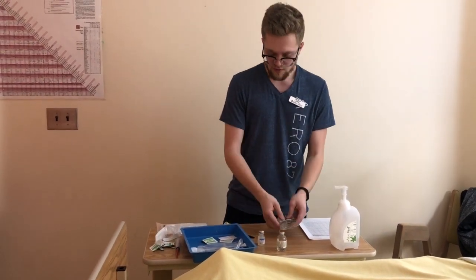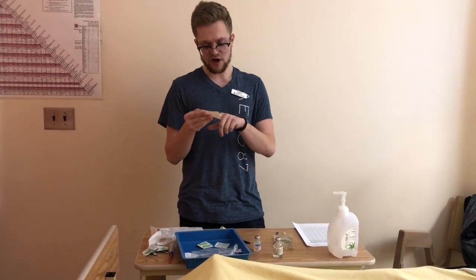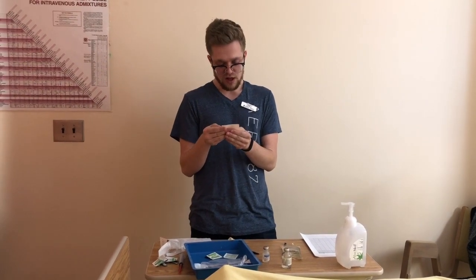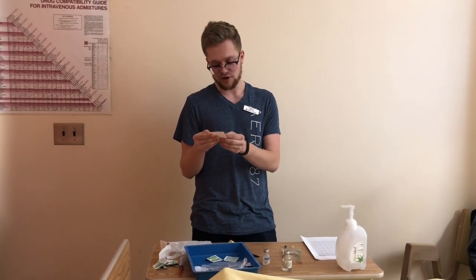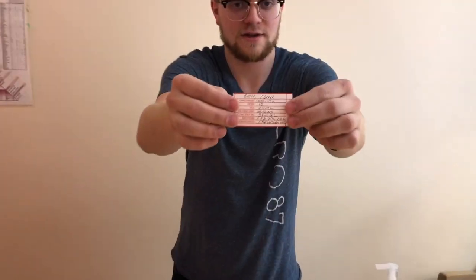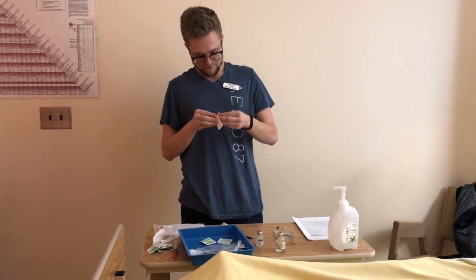So now that we have this, we want to make sure that we have a label for it. So I've drawn one up already. So this is for Clark Kent. We have the drug, the dose, the amount that's going to be in here. So 104 milliliters in total. I have the final concentration and dilutant on here, as well as the date and time and my signature. And I'll let you kind of just look at that. Okay, good. So I will take this off.